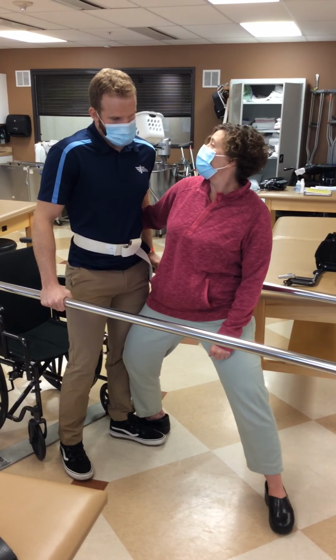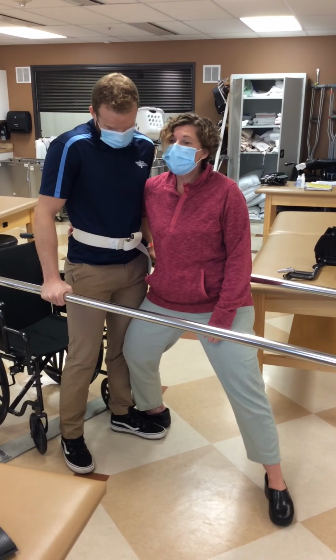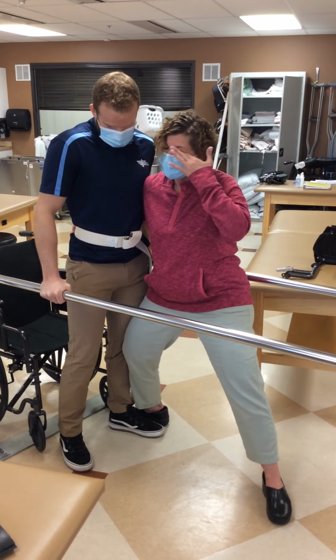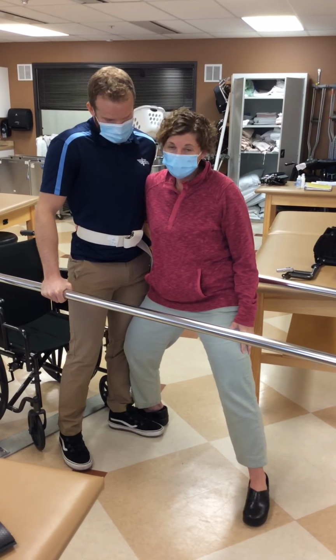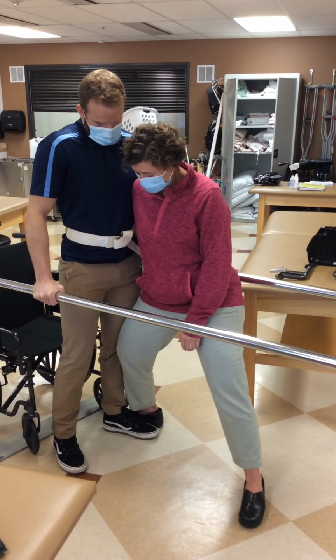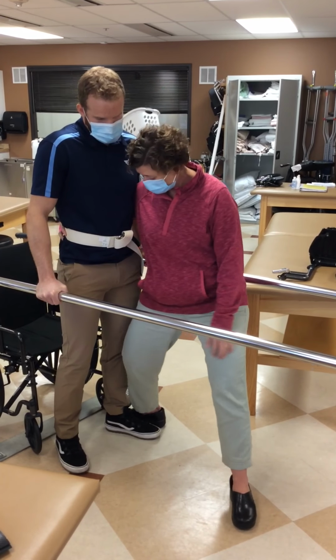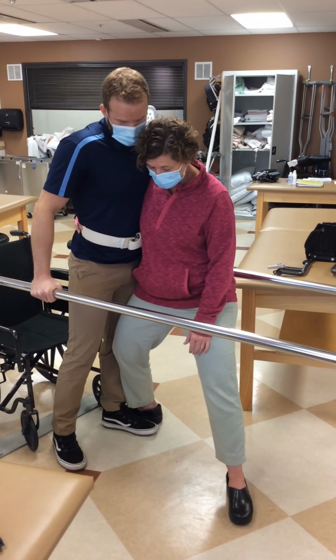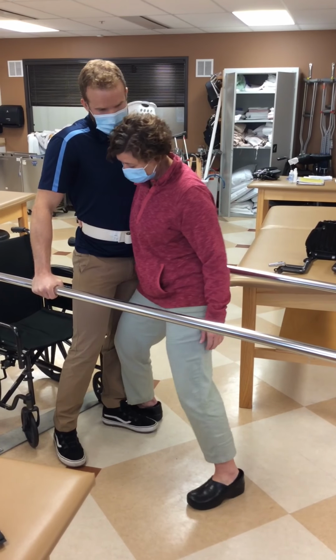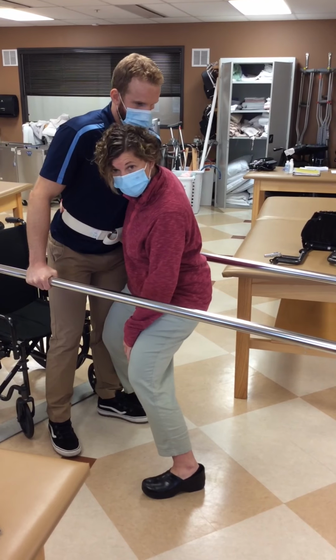All right, you ready to try walking? Yes. Okay, so if he is in this position, I can provide, honestly, anywhere from moderate to maximum assistance to contact guard, depending on the level of the patient, because I have good support. He's close to my body. So if he loses balance, all I have to do is extend that knee, pull him close to me, and then I can give him a cue to flex his hips and sit into his chair.